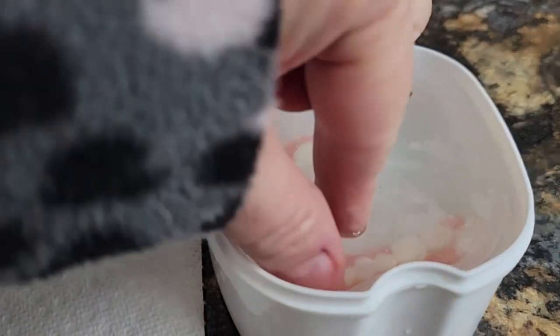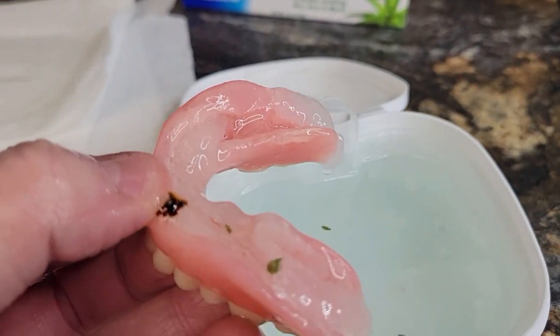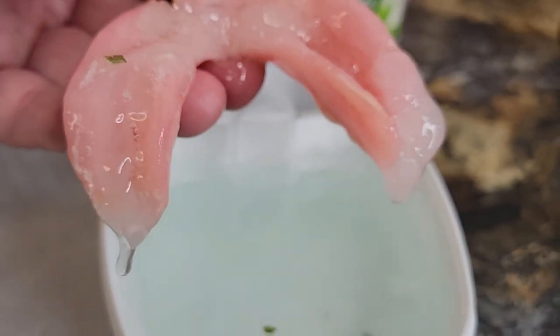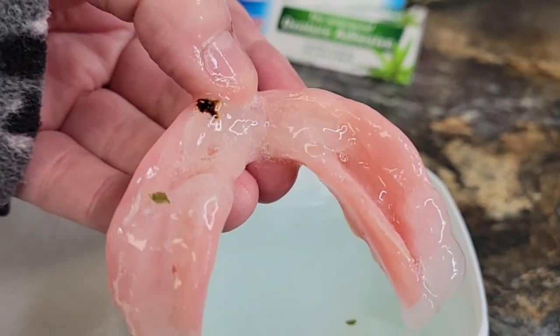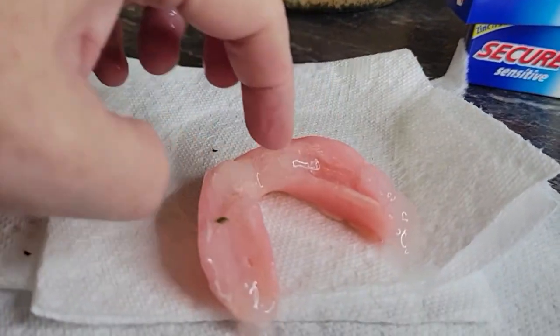Let's look at the other one. Oh, there you go. I know, there's food on there and it's gross, but do you see how big it is? It acts like a sponge and it collected all this water into there. Probably I could take that grossness off. Okay, let's dig some out of here.